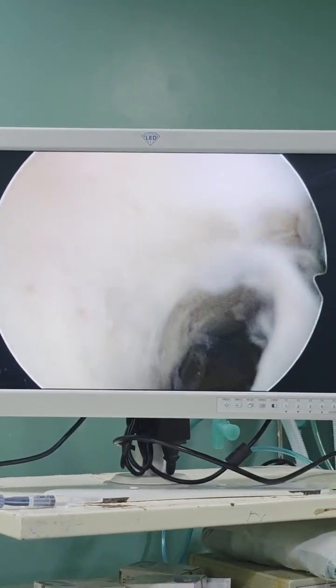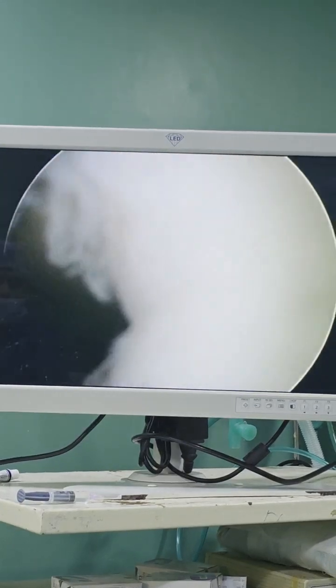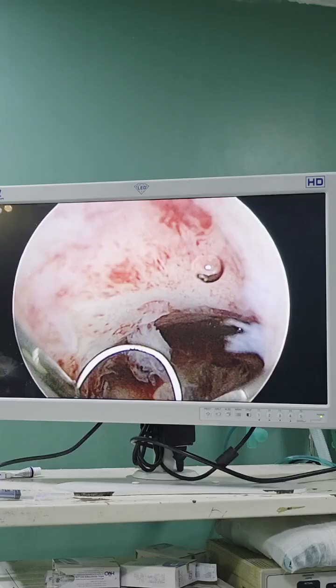Now you can see the hysteroscopic view of the isthmocele. Isthmocele is a Caesarean scar defect. You can see the dome shaped defect at the level of the Caesarean scar, and the uterus is adenomyotic here. Now, what is the concept behind?